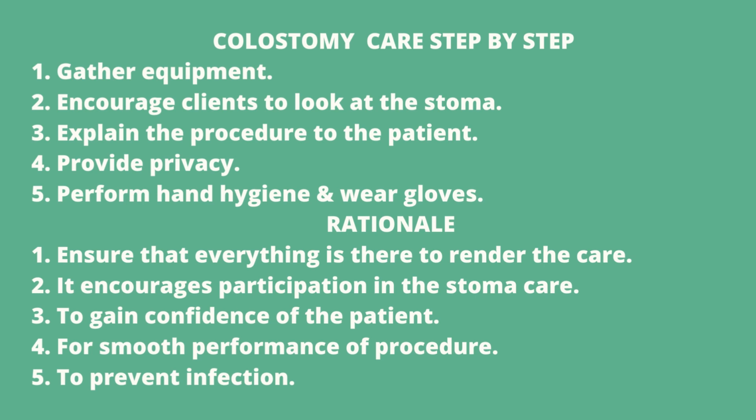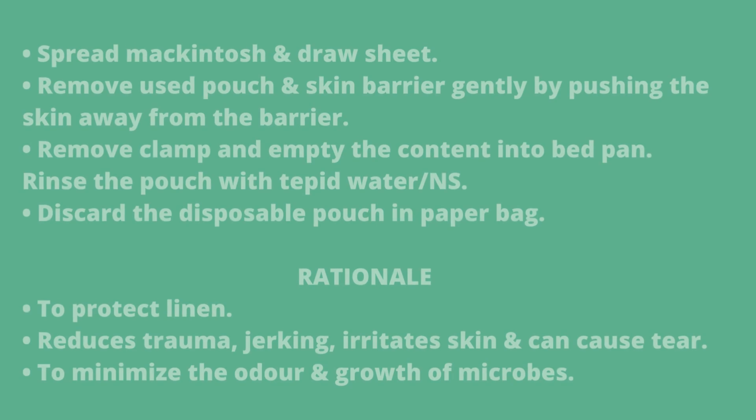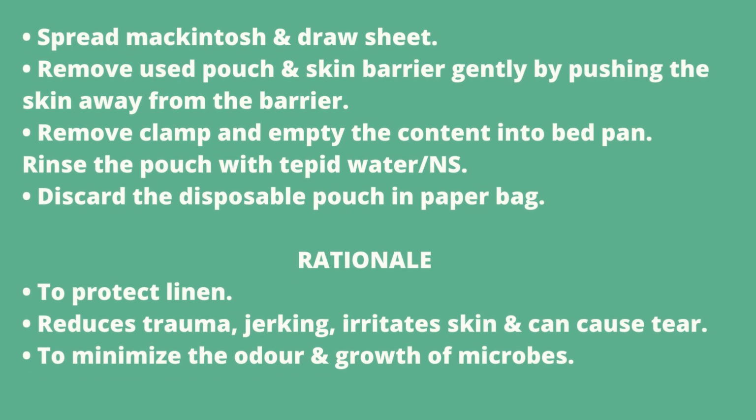Okay, fifth one is perform hand hygiene and wear gloves. ग्लोव्स वेयर करना है फॉर व्हाट, टू प्रिवेंट इन्फेक्शन, राइट. We need to perform hand hygiene also, to prevent infection, to prevent cross infection. Okay, next, spread macintosh and draw sheet. Okay, टू प्रोटेक्ट मैकिनटॉश स्प्रेड क्यों करना है, मैंने पहले ही बताया है.